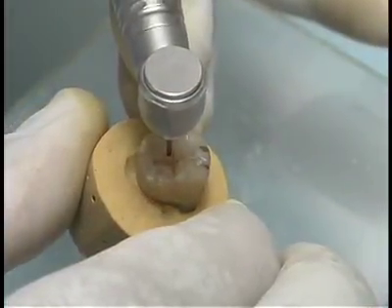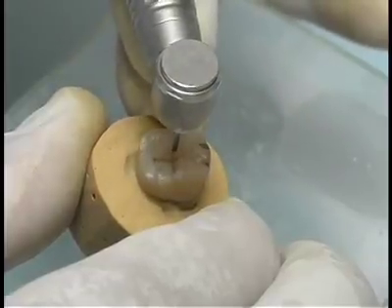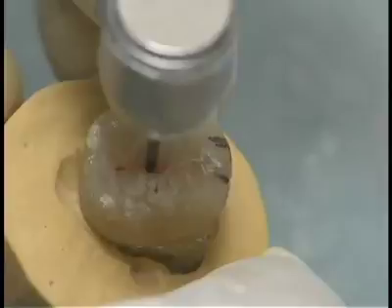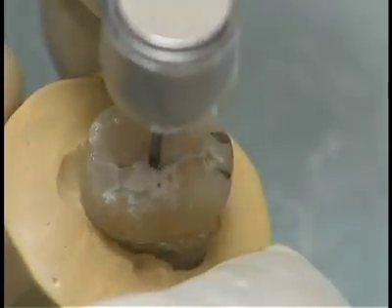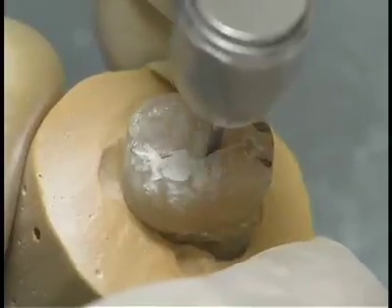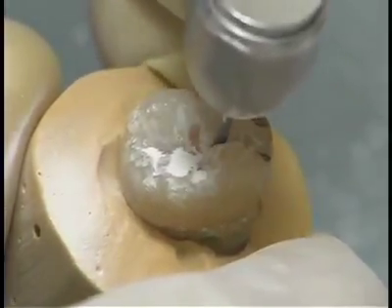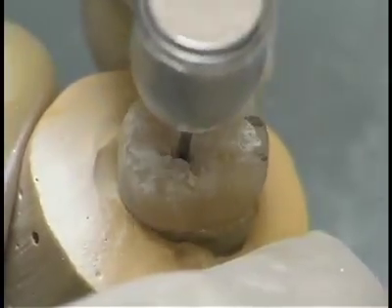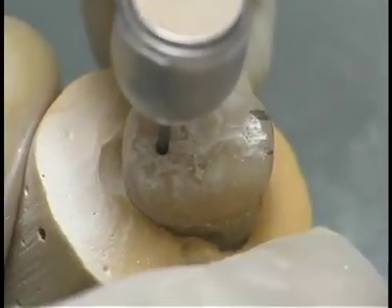The class 2 cavity preparation is done in two stages: the occlusal segment and the proximal segment. Penetrate the burr 90 degrees to the plane of the occlusal surface with the burr tilted slightly laterally for ease of penetration. The initial outline form should include only the faulty or defective occlusal pits and fissures.